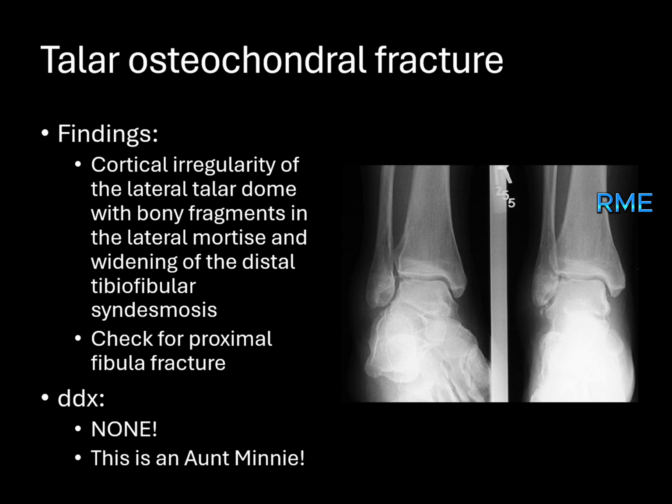To further evaluate, an MRI can help assess the extent of the osteochondral injury. Management involves immobilization and possibly arthroscopic surgery to remove loose fragments and repair the defect.